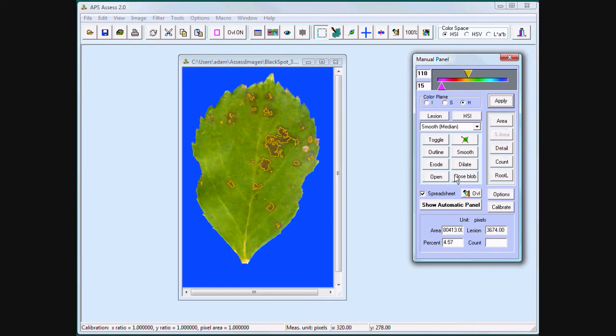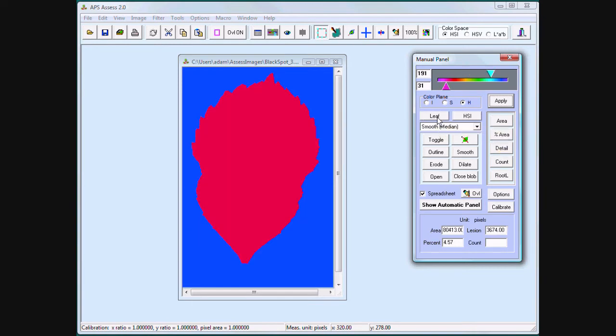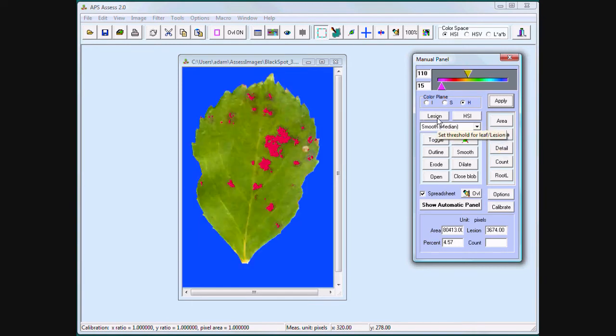Calculate percent area for all the lesions.